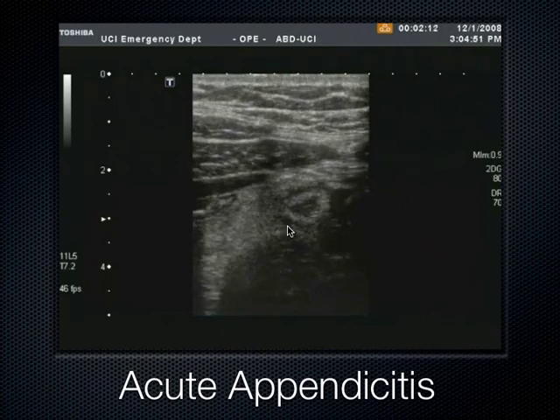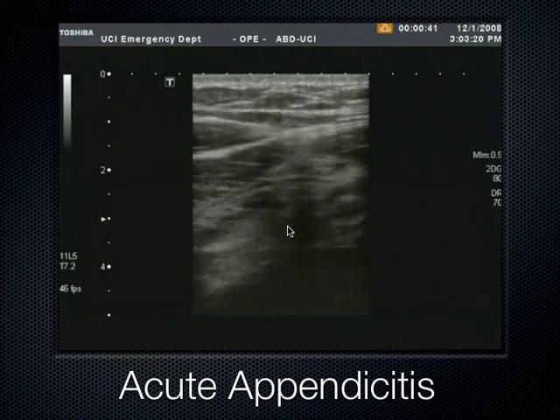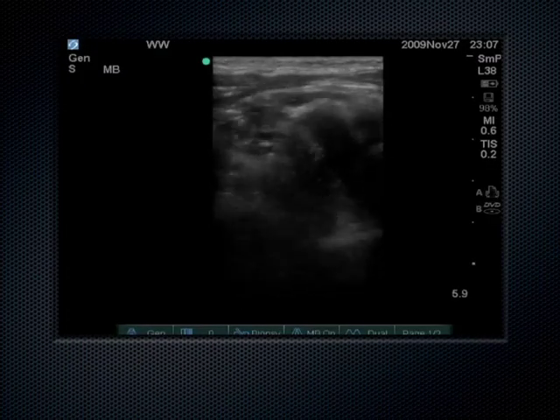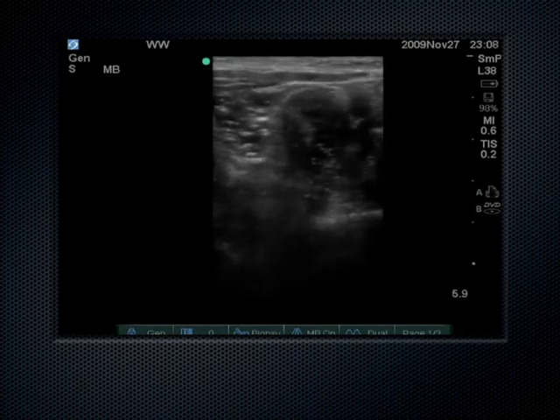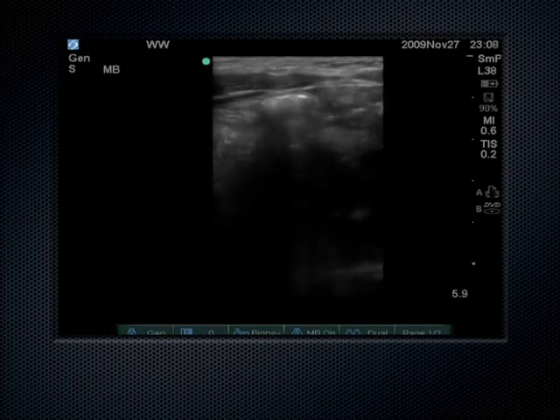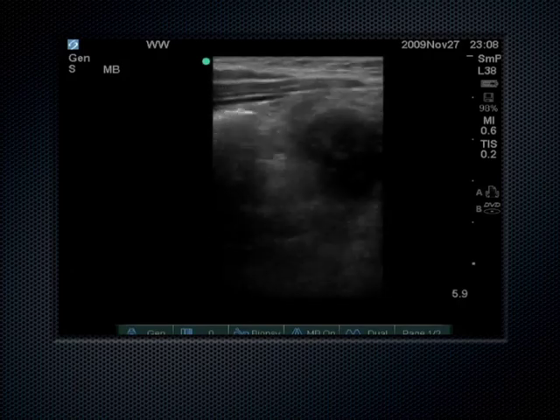And the patient lets you know too that you found their appendicitis in a very clear way as you're doing this. Sonographic Murphy sign, sometimes people call it. Not sonographic, but sonographic Murphy sign is for the gallstones. Sonographic McBurney's sign is what some people call this, because the McBurney's point is the location where the appendix usually lies in the right lower quadrant, which I know you guys have been studying.